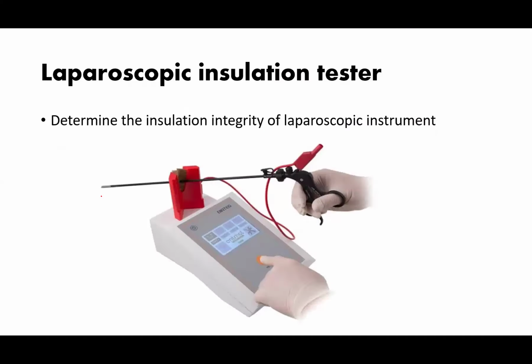Now, the laparoscopic insulation tester. All these instruments are insulated to prevent burns of tissue when you are passing energy through that instrument. So you need an insulation tester that will confirm the integrity of the insulation of that device before using it, or if you have been using it for a long time.